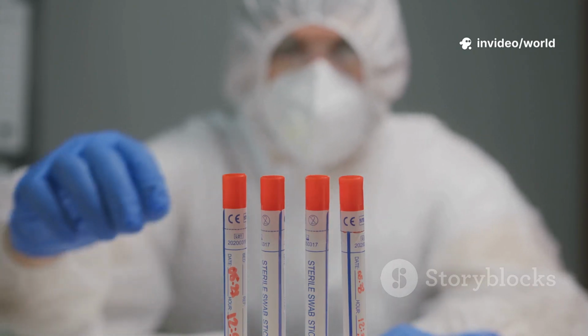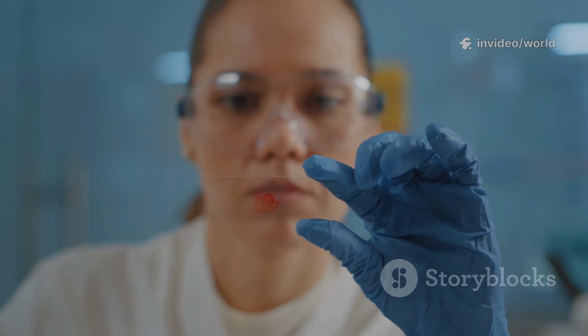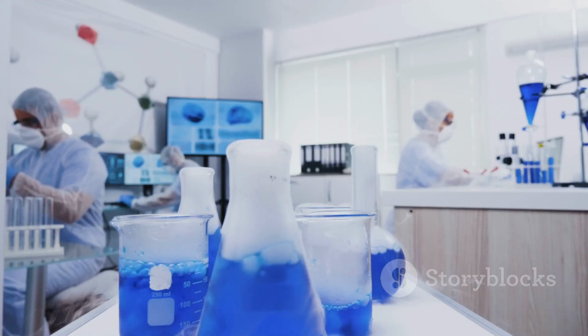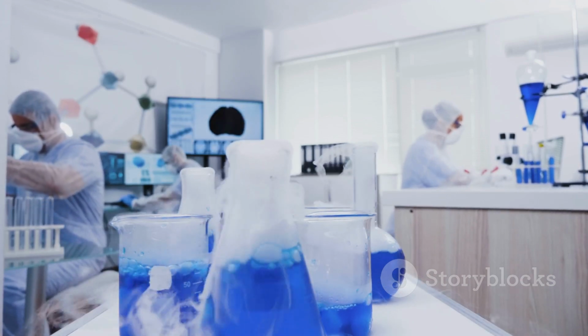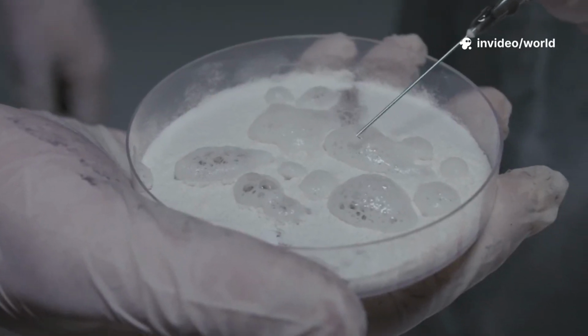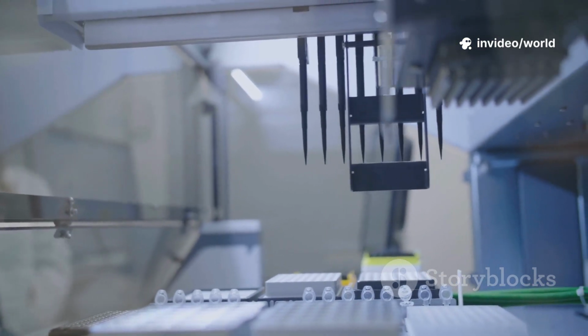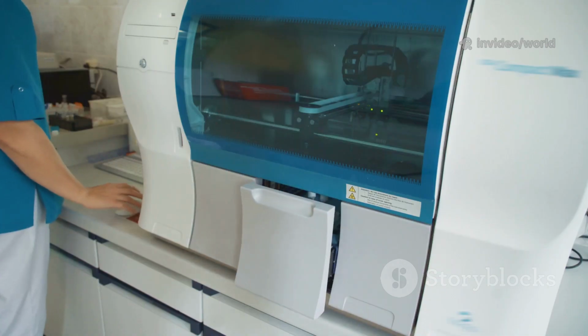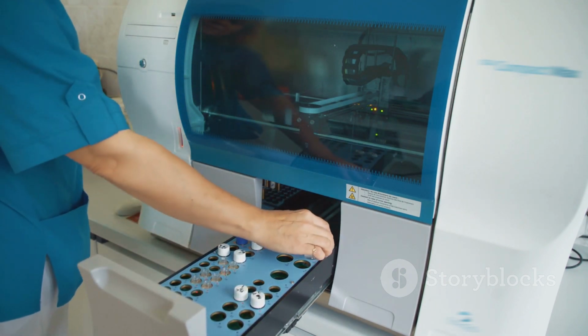First, sample collection, usually sputum, but it could be other specimens. Next, decontamination. I use the NALC-NaOH method to wipe out other bacteria and let the mycobacteria shine through. After that, it's time to inoculate the sample into a liquid medium. Think MGIT 960 system. This is automated, so it keeps an eye on the tubes, watching for any signs of growth for up to 6 weeks.